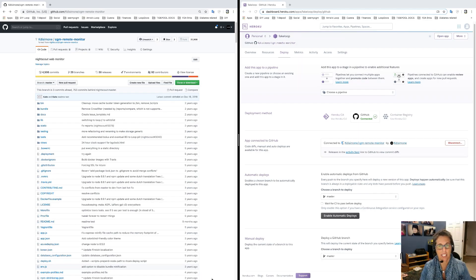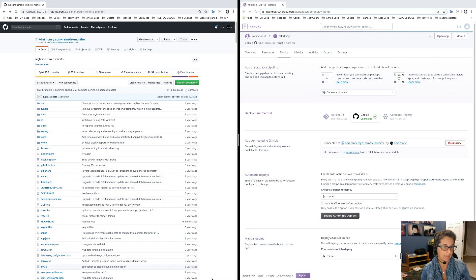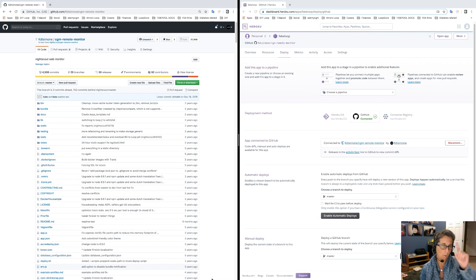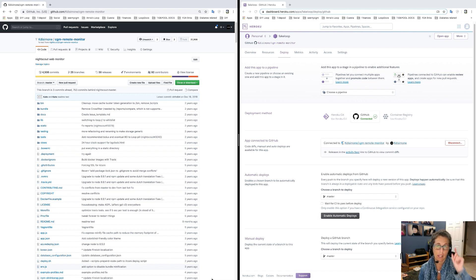Hey guys, it's Katie here. I'm here to talk today about updating your Nightscout site. If you ever hear you need to update your Nightscout site, there are two parts to this: one, you have to update your code in GitHub, and two, you then have to deploy that new updated code in your Heroku account.